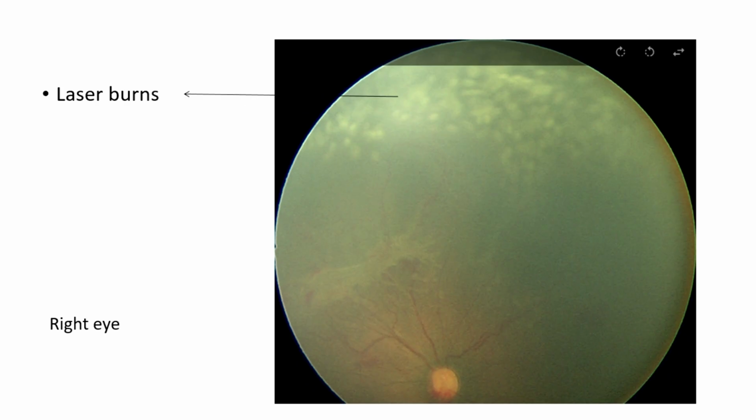All right. I just wanted to show you this. This is called the loop. A lot of you are going and seeing ROP. This loop vessel is abnormal, which means the tissue within it is avascular. So you have to treat this. And this we have done after the child is stabilized.